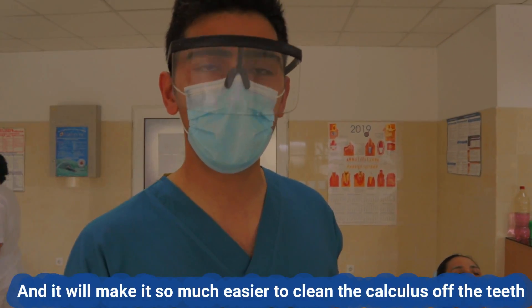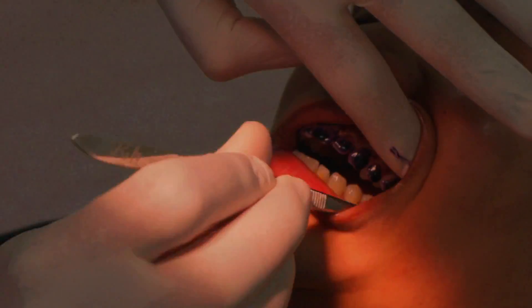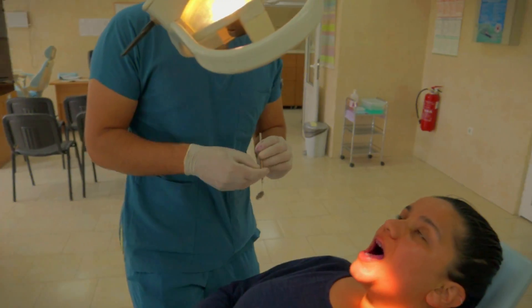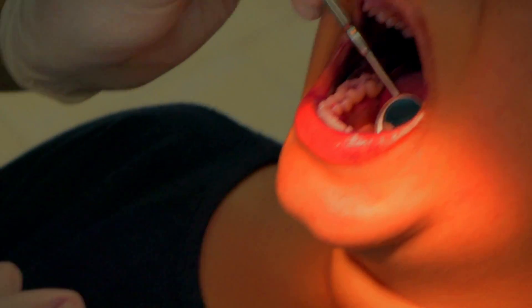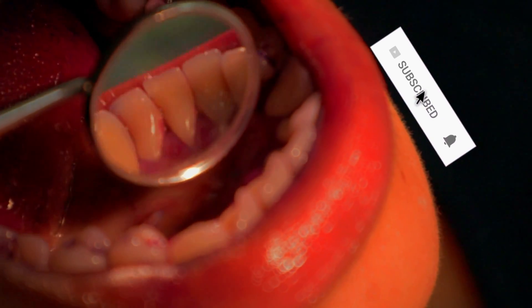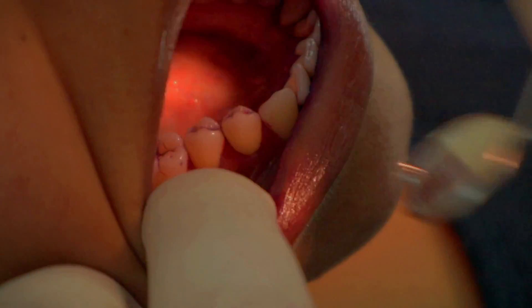I used my forceps to grab a piece and move it all around the teeth, ensuring that I cover all the surfaces of all the teeth in her mouth. I asked the patient to spit out and then I used my dental mirror to check the surfaces of the teeth to find out which places exactly need cleaning. You see the pink between the lateral incisor and central incisor — that pink shade color means that the debris is there that we need to remove. You can see some here on the molar as well.